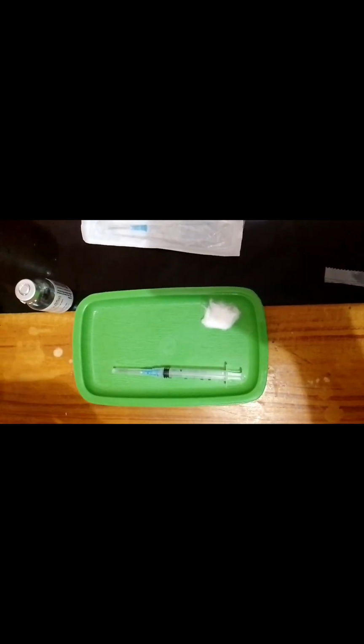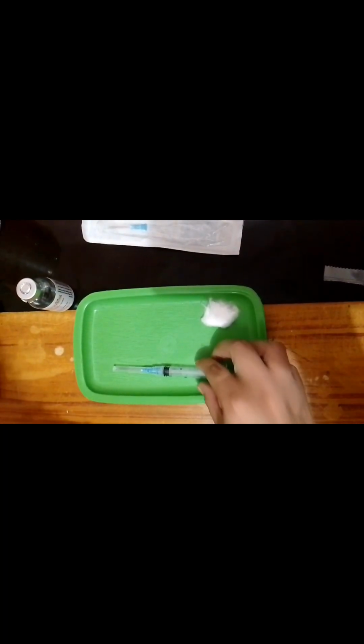And since we already connected the syringe to the aspirating needle, we need to make sure that it's not loose to avoid injury. And after that, uncap. And then now we can open the medication vial. Now since the vial seal is exposed, clean the surface with a cotton soaked in 70% alcohol. Do this for at least 30 seconds.